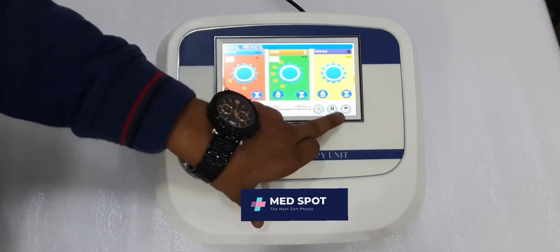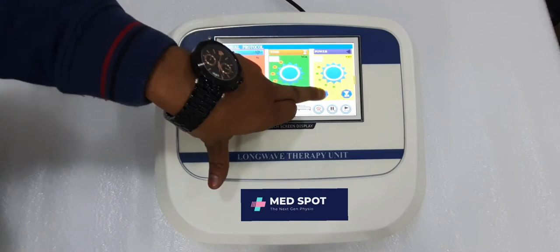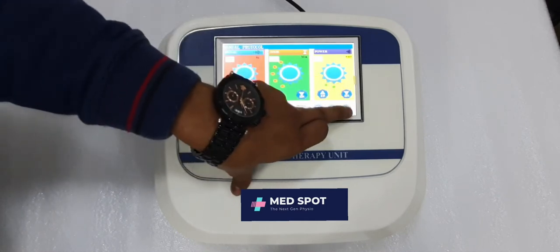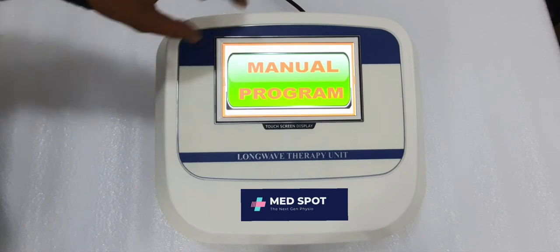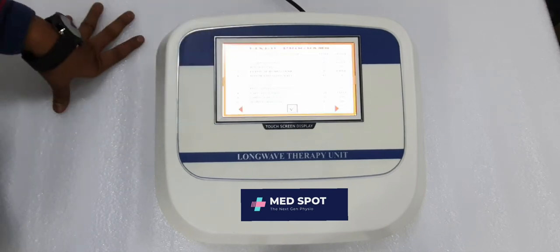Start the machine and then raise the intensity. As you can see, the intensity is raising and decreasing. After using it, simply press stop and OK.